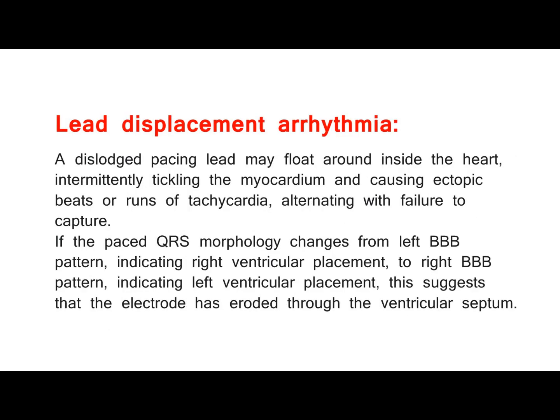Lead displacement arrhythmia. A dislodged pacing lead may float around inside the heart, intermittently tickling the myocardium and causing ectopic beats or runs of tachycardia, alternating with failure to capture. If the paced QRS morphology changes from left BBB pattern, indicating right ventricular placement, to right BBB pattern, indicating left ventricular placement, this suggests that the electrode has eroded through the ventricular septum.